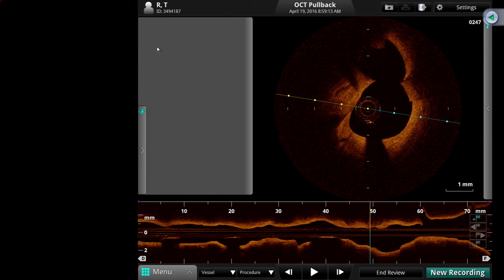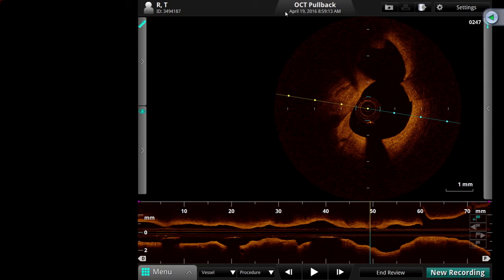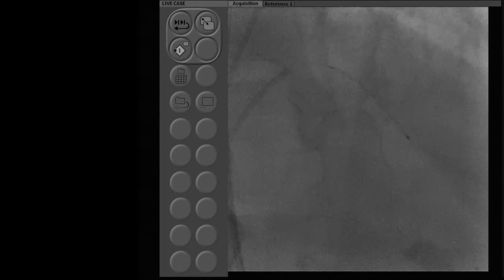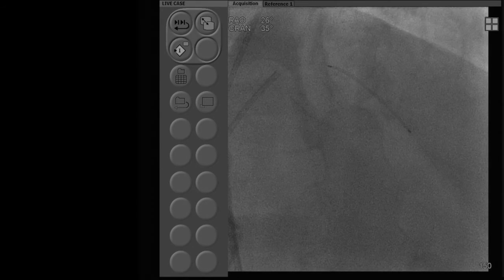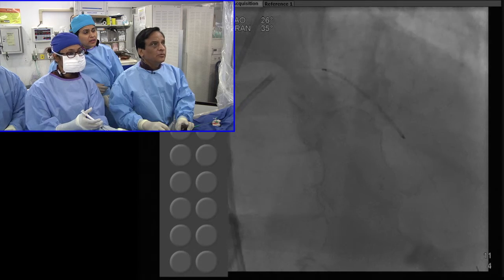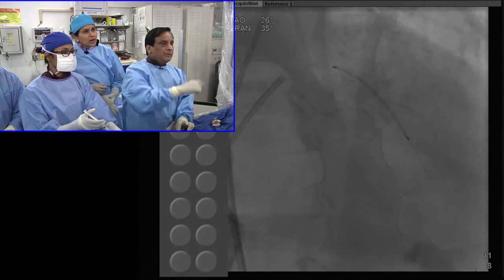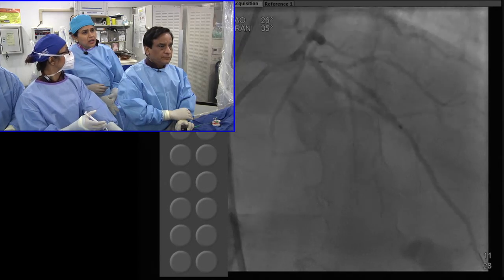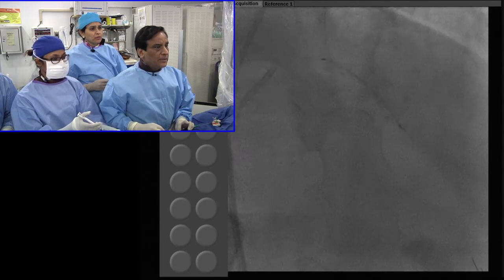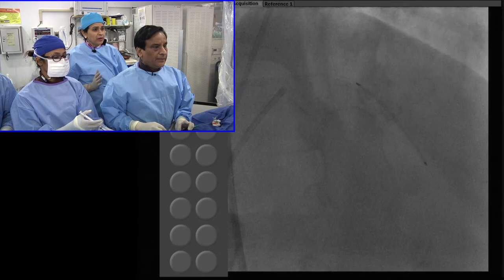We have a 3.25 by 38 millimeter Zions Alpine and we are ready to put it. Although my heart does not believe it — if not a live case I would have definitely wired the diagonal — I think we go with the science. I always believe in changing practice based on science and literature and particularly our own data. There is a proximal 30 to 50 percent lesion also. There are lesions both distal and proximal. We need to cover the distal lesion, and then proximally we may do one more stent. Make sure it is not a double layer at the level of the side branch.